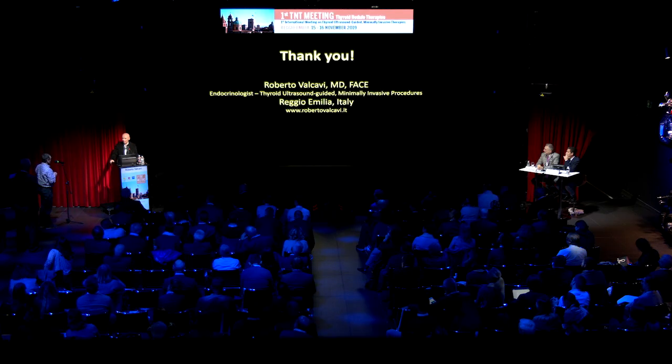The problem with leaving some ethanol inside is adhesions. If after a while the patient becomes a candidate for surgery, the surgeon will bless you because of adhesions, especially in cysts which extend to the laryngeal nerve. So I would recommend washing out many times until the fluid is clear, and this is my technique.